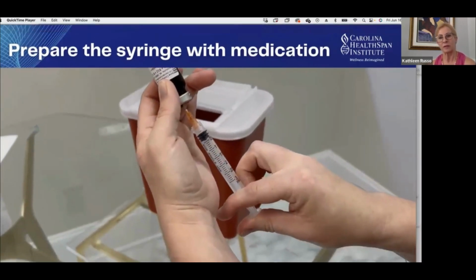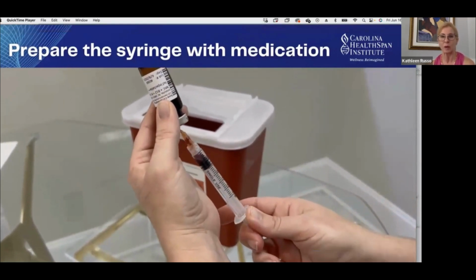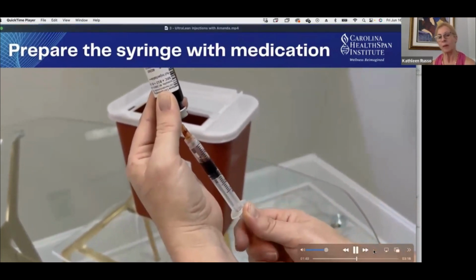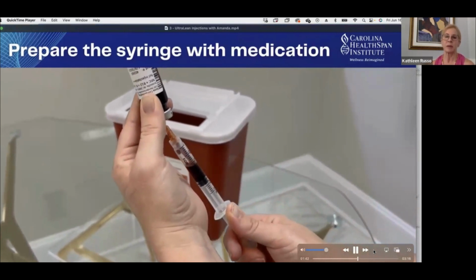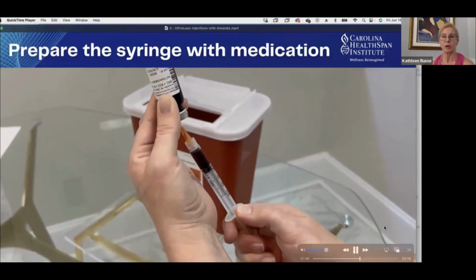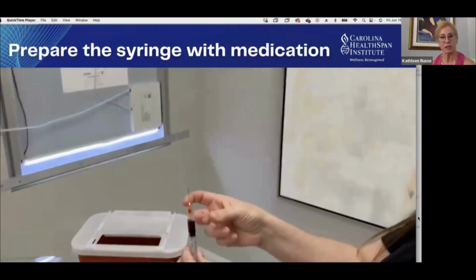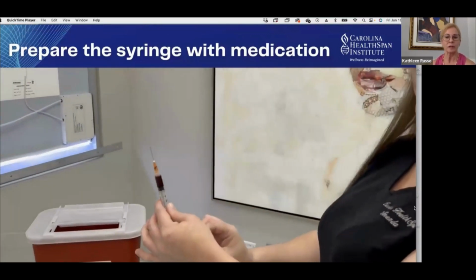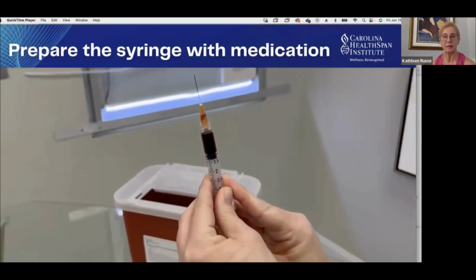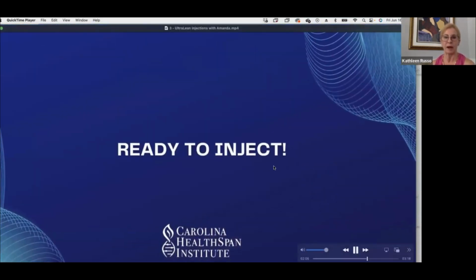And you can see that little flash of red at the needle. That's the medication. In this case, it's red. That's why it looks that way. She will fill the vial to just beyond the 1, and then she'll inject some of the medication back into the vial to get exactly 1 ml, and that way she'll be discarding some air that may have accumulated. This is an intramuscular injection. It is not vascular. And so if there is a little bit of air in your syringe, nothing to worry about. You are not going to hurt yourself if there's a little tiny bubble in there. But you do attempt to remove whatever air you can.